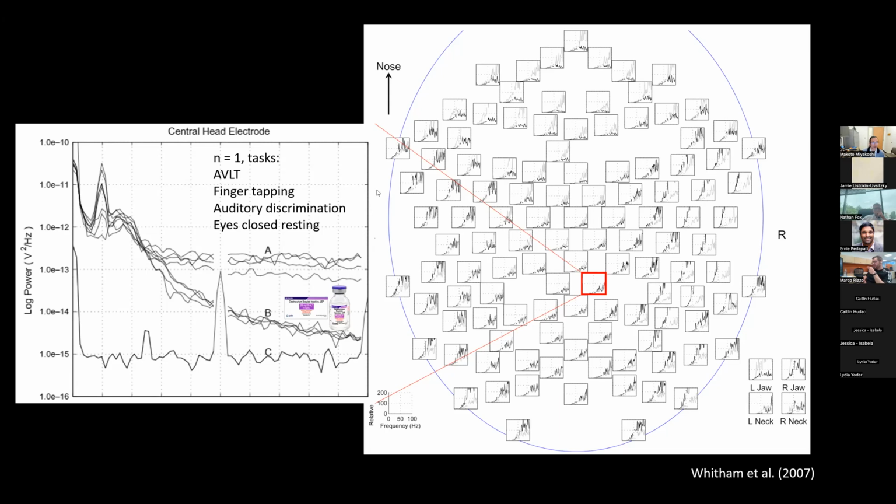So it's very obvious that without the muscle contribution, the 1/f-ness of the EEG power spectrum density is very clear, right? And with the muscle contribution, it kind of reaches the floor, which is rather flat towards the higher frequencies. So this always happens, and everybody's data contains this muscle contribution all the time, so we have to remember that all the time, right?